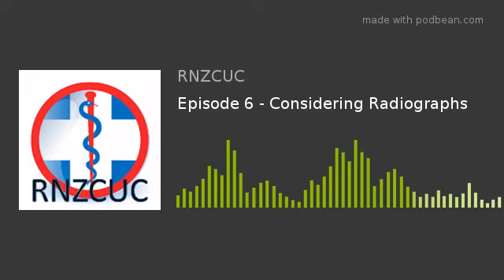I position it with the patient seated next to the table, their arm abducted out over the table, and then their body leant across as far as they can. So we're shooting the X-ray beam down through the top of the shoulder joint. So that's the one we need to be most aware of in terms of pain. The rest are done standing and fairly easy to position.